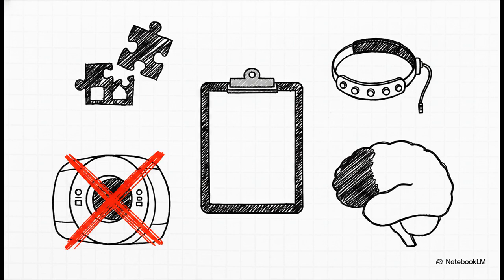Of course, to keep things strictly scientific, we absolutely have to talk limitations. As we touched on earlier, this is validated only for the NIRSIT Lite configuration. It's based entirely on prefrontal oxyhemoglobin connectivity. It absolutely does not replace anatomical co-registration or whole brain imaging techniques like fMRI. And most importantly, while strong within ROI connectivity supports functional coherence, it doesn't definitively guarantee that each grouping uniquely measures one and only one cognitive construct.